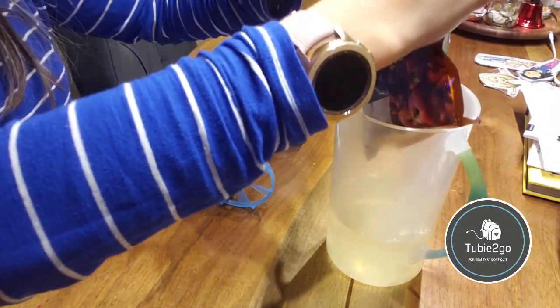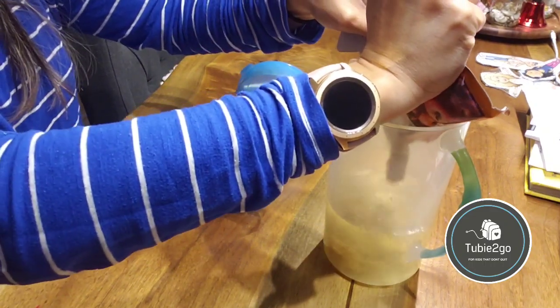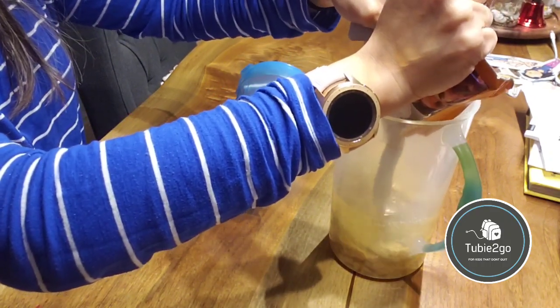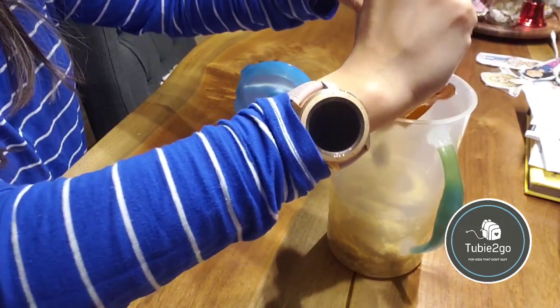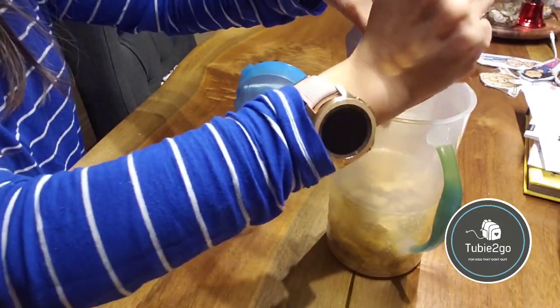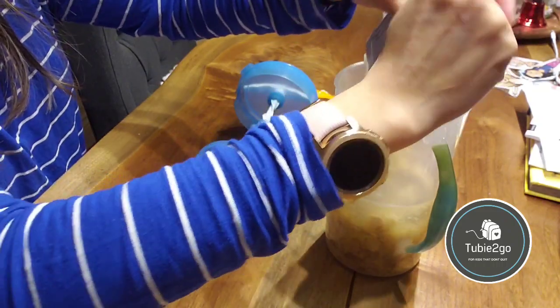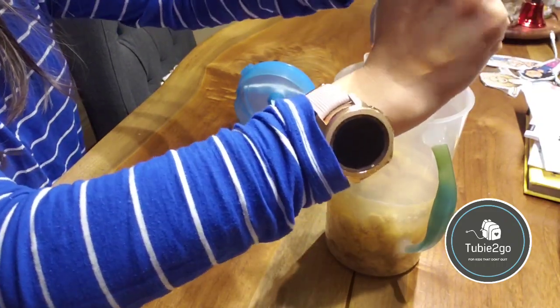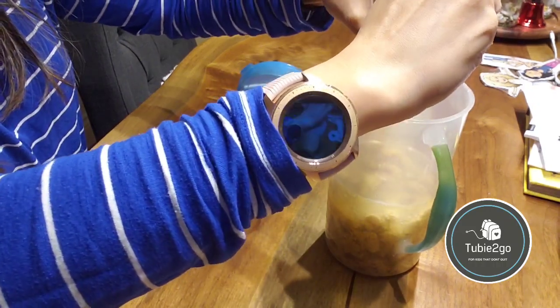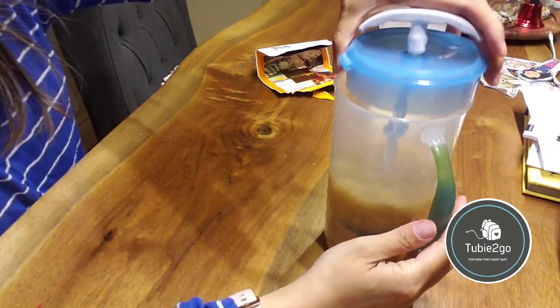This is a package of Real Food Blends — it's the egg meal, which is super thick, so we definitely have to mix it with some liquid. I think most other tube feeders probably don't need quite as much liquid top-up as Magnus does, but I will show you what a good job this formula mixing pitcher does.